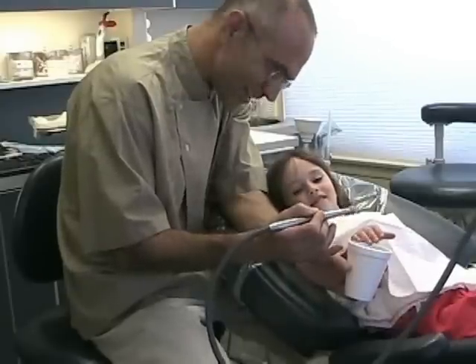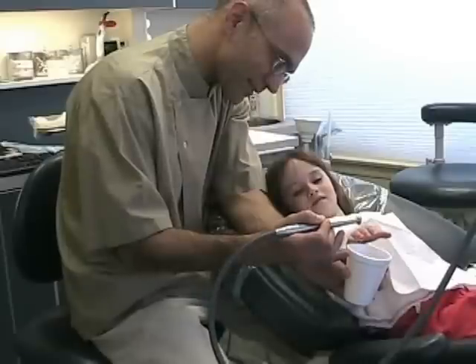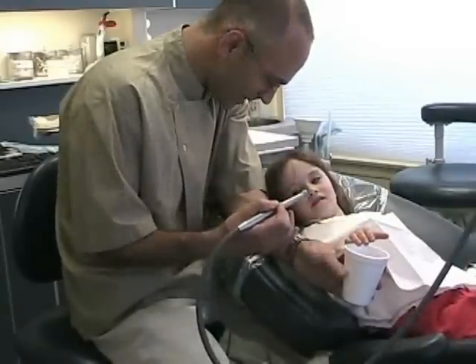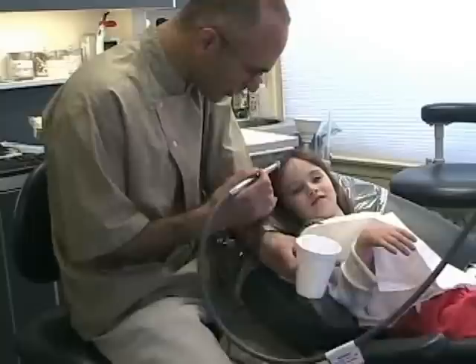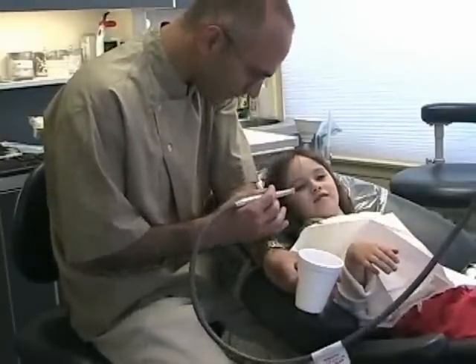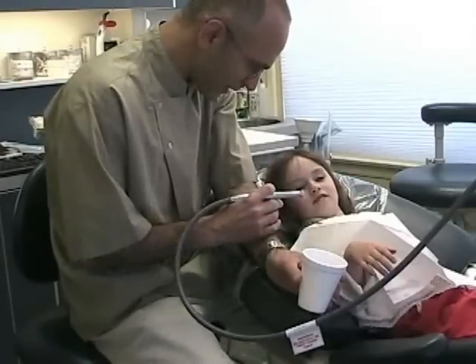It tickles sometimes, right? Yeah. It may also tickle the tooth, but that's okay because the tooth also has some nerve to tickle. So we're going to do that on the tooth a few times, and then we're going to count to five every time. And then we're going to give it a rest so you can close your lips around that straw.